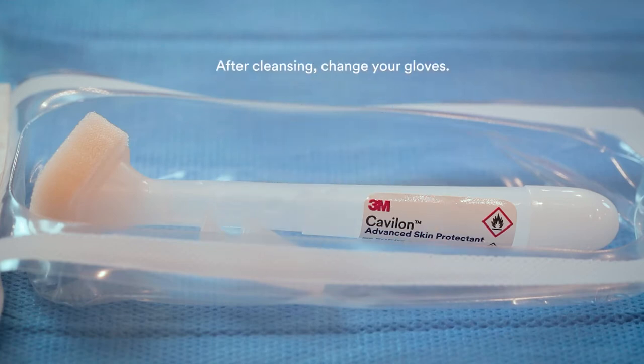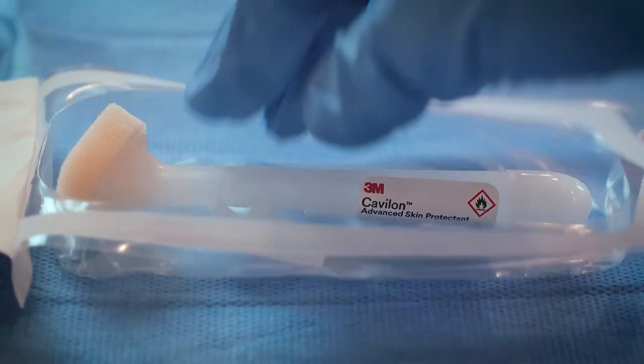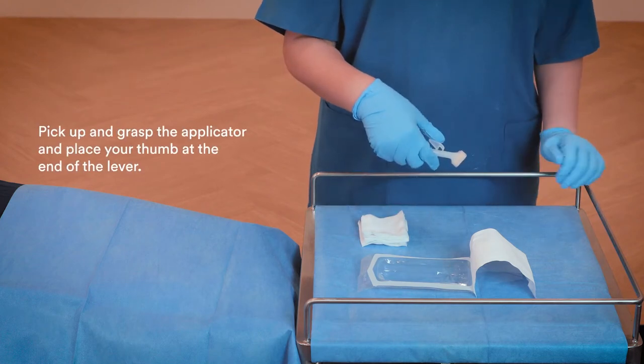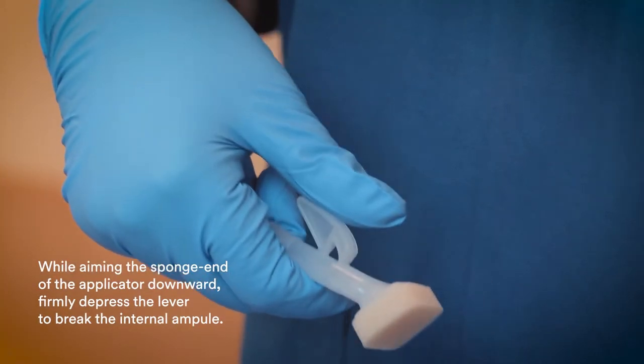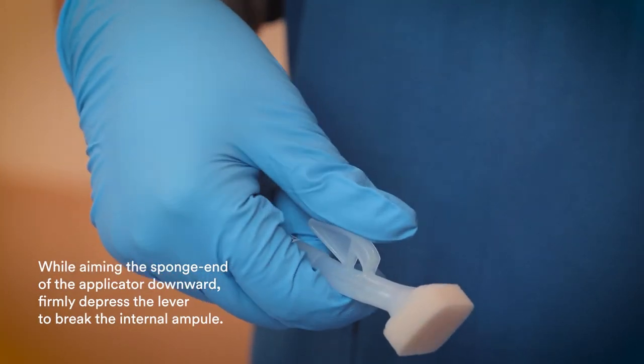After cleansing, change your gloves. Pick up and grasp the applicator and place your thumb at the end of the lever. While aiming the sponge end of the applicator downward, firmly depress the lever to break the internal ampule.